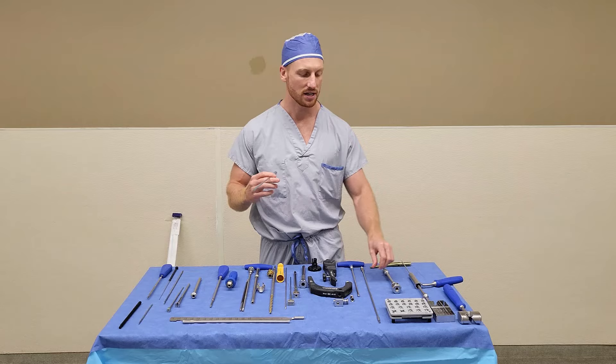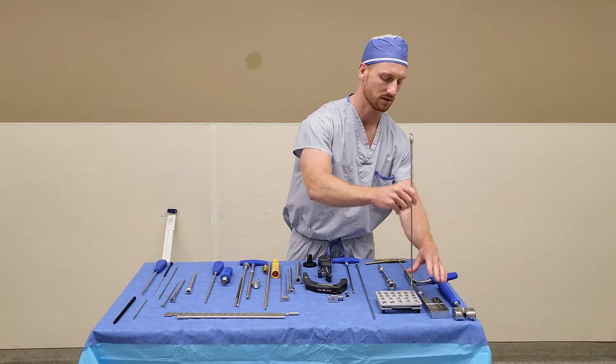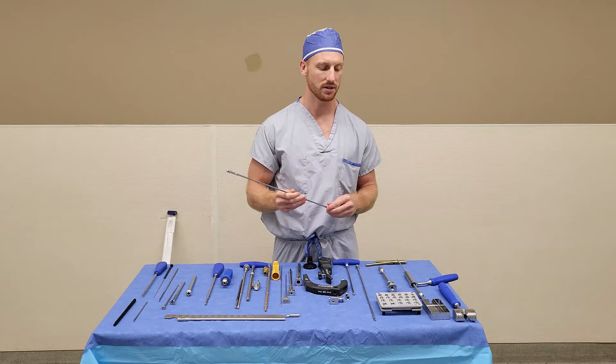You have two identical reaming shafts and a multitude of reaming heads labeled by their diameter. To load, simply press in and twist. You'll hear it click — the reamer is now loaded. Attach it to your power assembly, hand it up, and ream up sequentially.